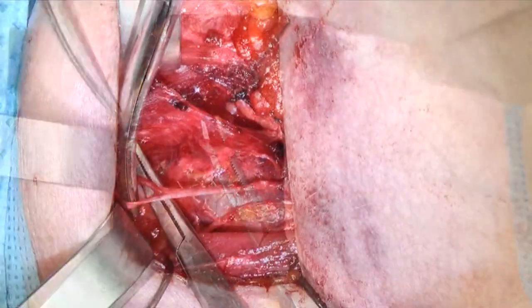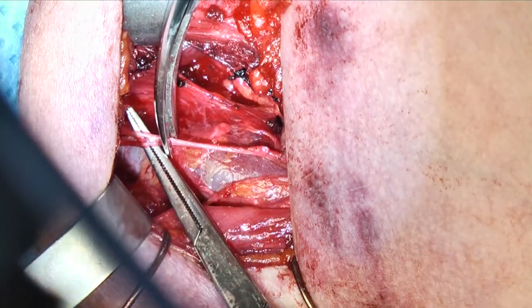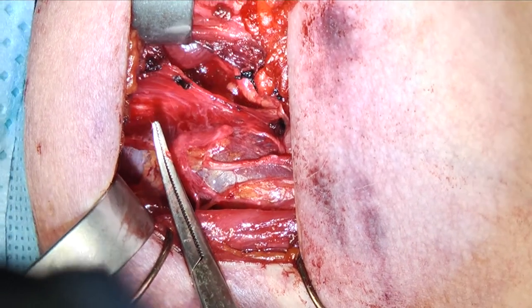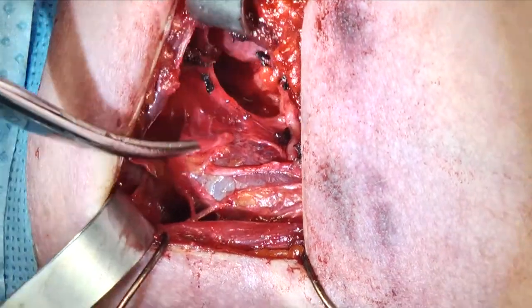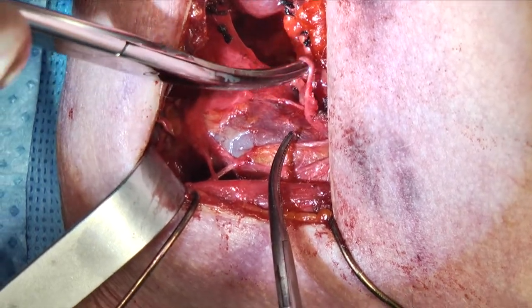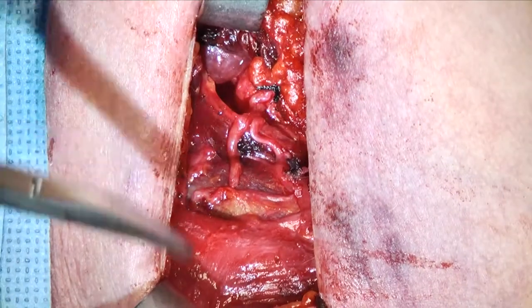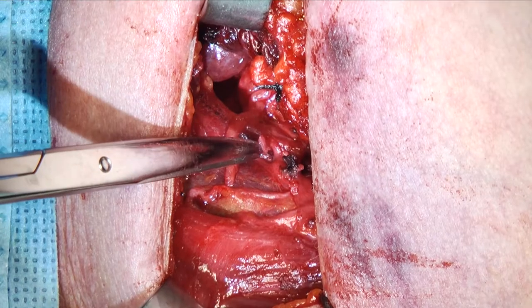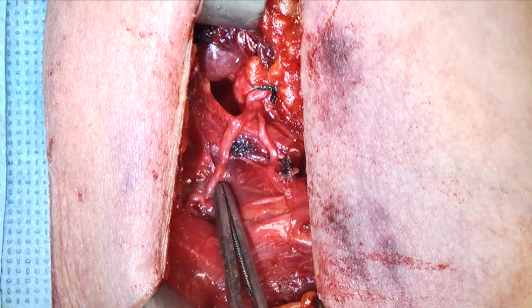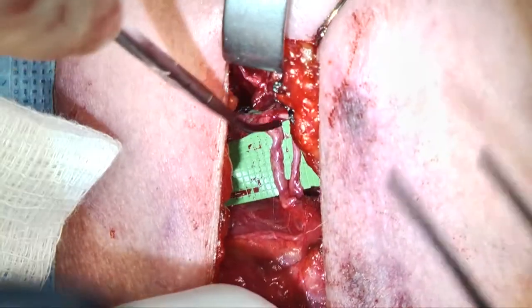Here's our ansa cervicalis — there's the branch and the common trunk. I'm cutting it right where it branches into those two branches at the base of the common trunk of the ansa cervicalis. We swing it on over. You can see the IJ clearly, and here you can see we have a lot of excess nerve, which is very nice. Showing the ansa and then the recurrent next to it — this is a bit of a side view we've been using while trying to find the recurrent nerve, so now superior is off to the right.